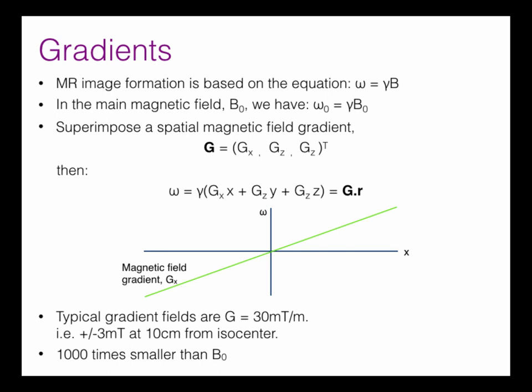Let's take one that goes from left to right. You'd have an additional magnetic field that adds on top of the existing B0 or subtracts from it, and there's not much effect in the middle. These are the magnetic fields that make the sound in the magnet, when we pulse them on and off.